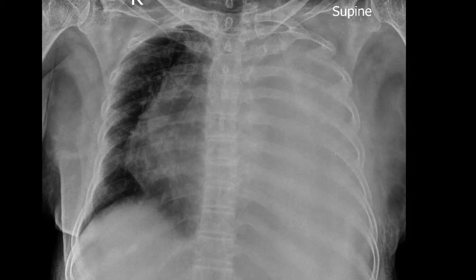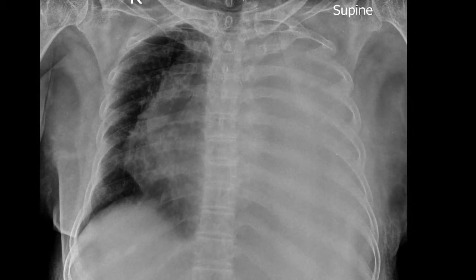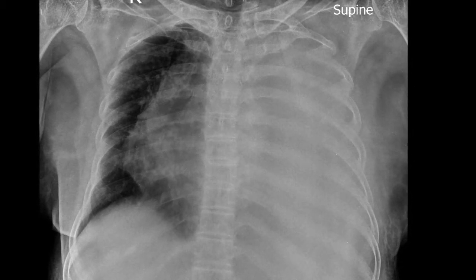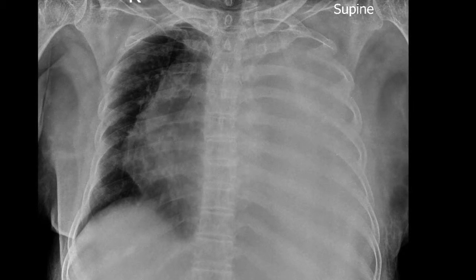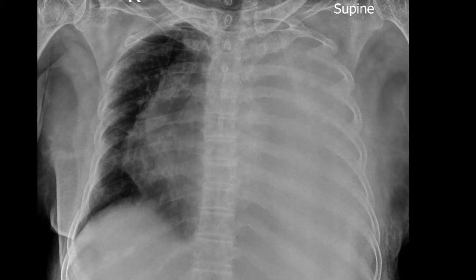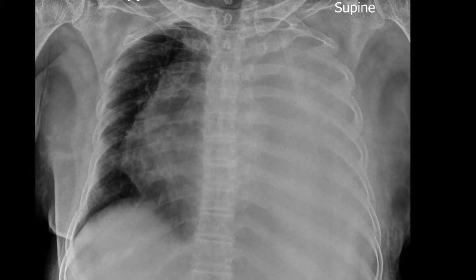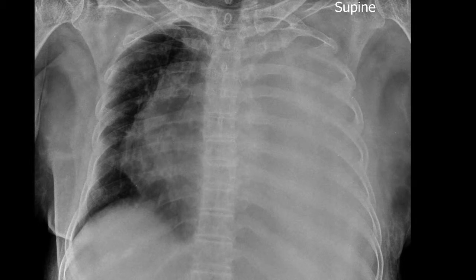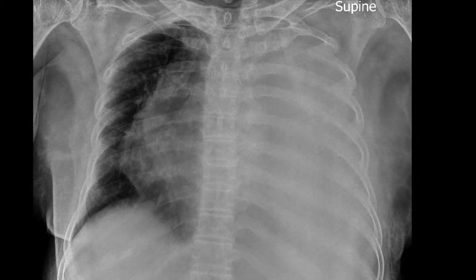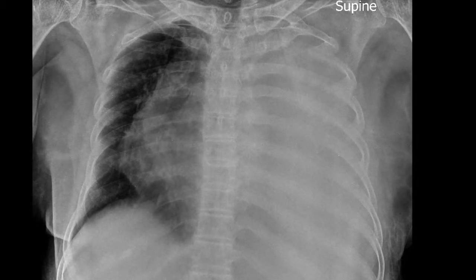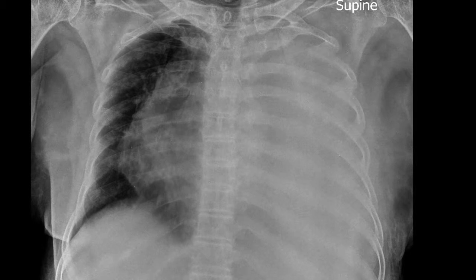It can also occur sometimes in a diaphragmatic hernia, but in those conditions you would of course see the bowel also being part of that opacity on the left. So in this patient particularly, we are looking at a pleural effusion versus a large pulmonary mass.